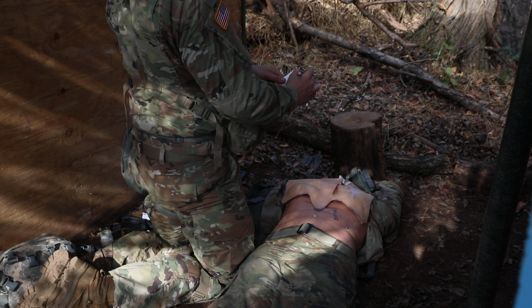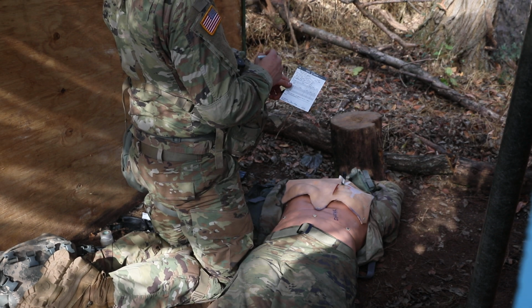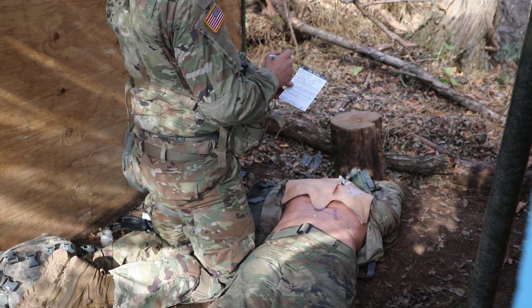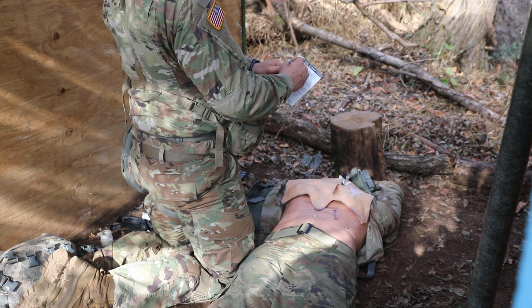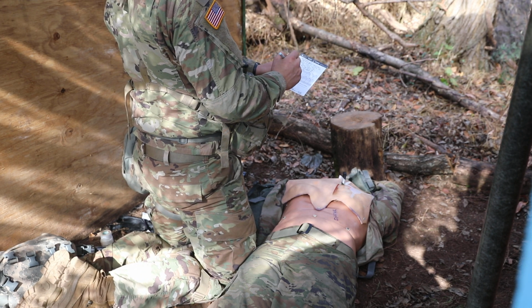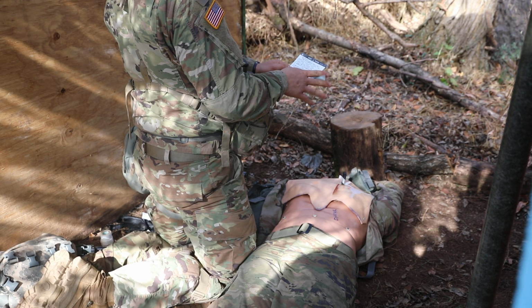Evacuation. Mark an X on the casualty's evacuation priority or precedence. Urgent. Mark an X for all circulation hemorrhage control interventions. Needle D, chest seal. Mark an X for all breathing interventions. Needle decompression, chest seal.